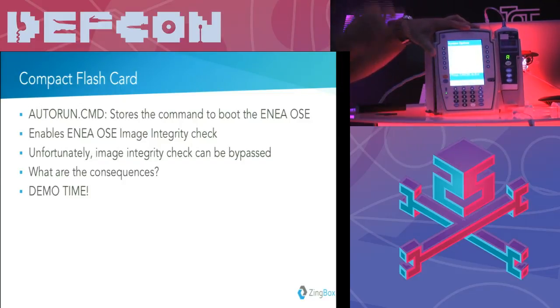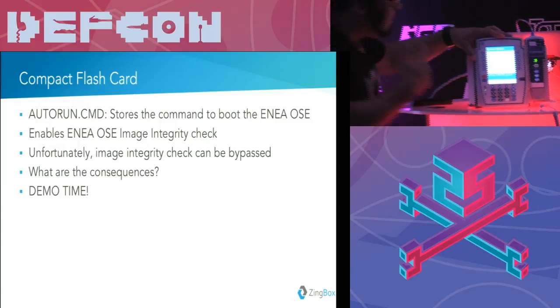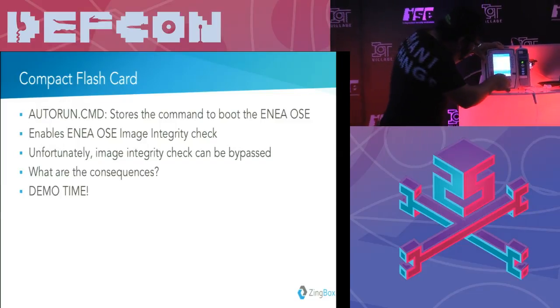And that gives you access to the configuration. You can see here that the pump is trying to associate with a default Wi-Fi, right? So it's something that is already inside, it's already in the ROM. We cannot touch it, we cannot change it. But at least we know the SSID. Later we can see how we can modify this. So this is another example, right? You can change PIN numbers, you can change sensitive access to the pump. But let me show you the most interesting one.